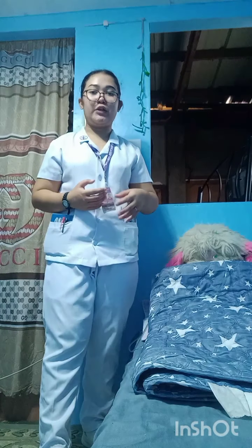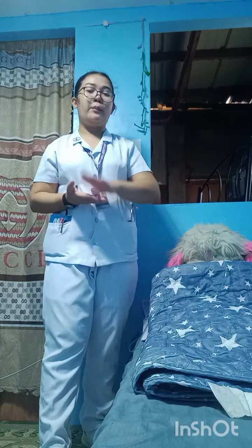It is really necessary na kailangan natin i-document yung mga findings, lalo na if may napapansin kayo sa patient during your assessments na may mga pagbabago or di kaya yung level of oxygenation ng patient, pwede mo yung ilagay. Also, your vital signs ng patient, also yung assessment na ginawa mo if may mga clinical signs kang napapansin gaya ng hypoxia, cyanosis, lalo na dito sa may kamay or dito sa may bibig ng patient, if bluish pa rin siya, pwede mo yung ilagay sa notes mo para i-transfer mo siya doon sa form or checklist ng ating patient.